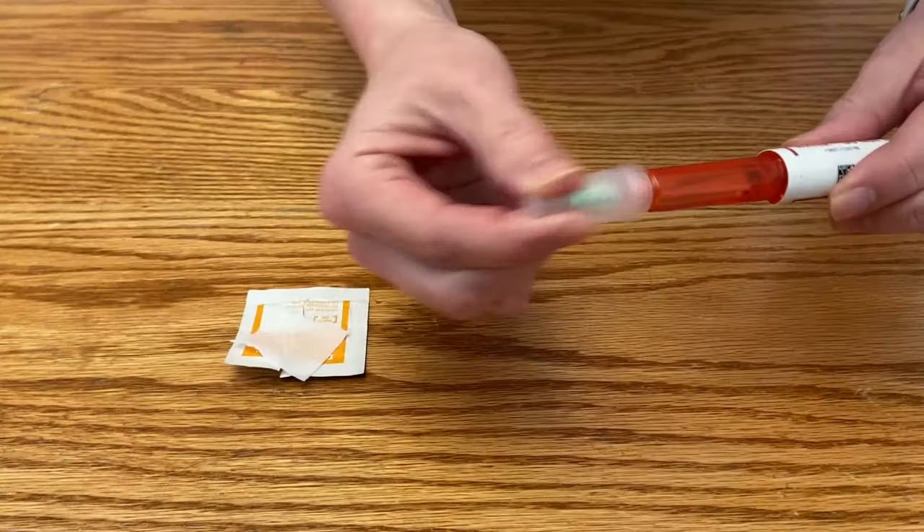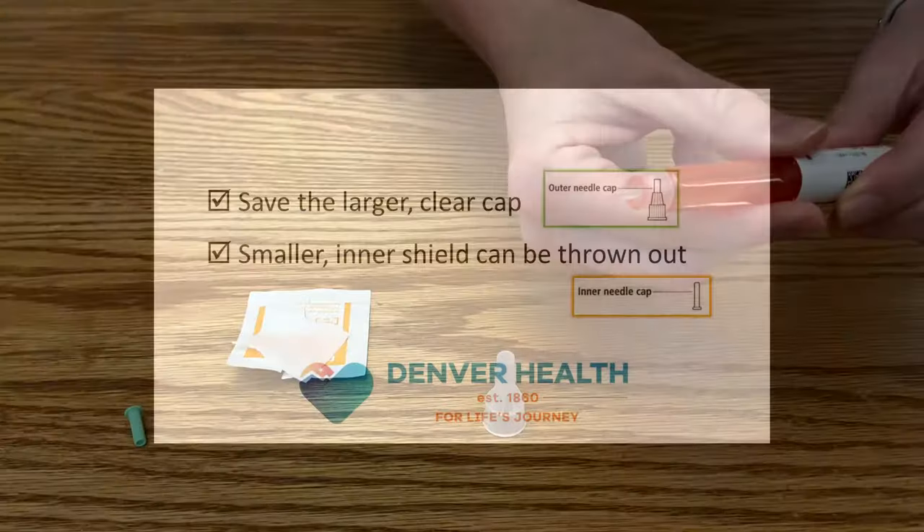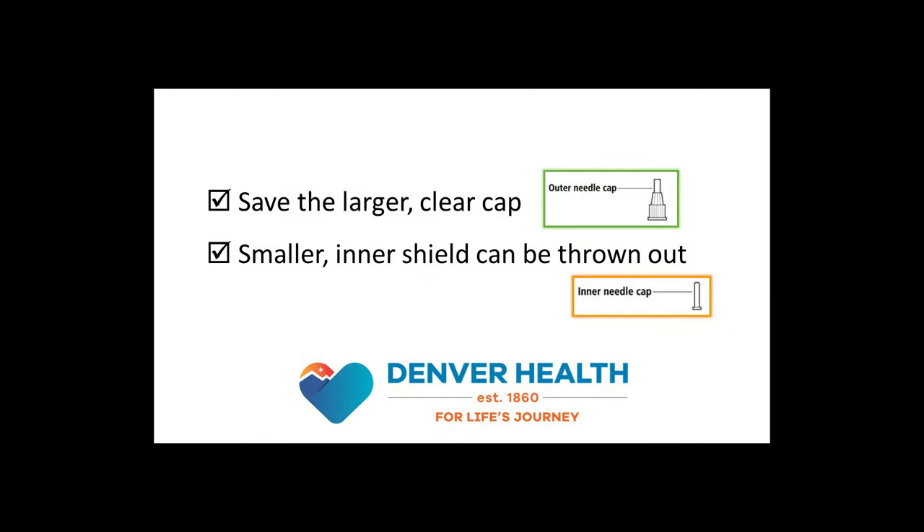The next step is to remove the two safety caps on the needle. Set aside the larger, clear cap because when you're all done, you're going to use it again to safely remove the needle. The smaller, inner shield should also be removed, but can be thrown away.